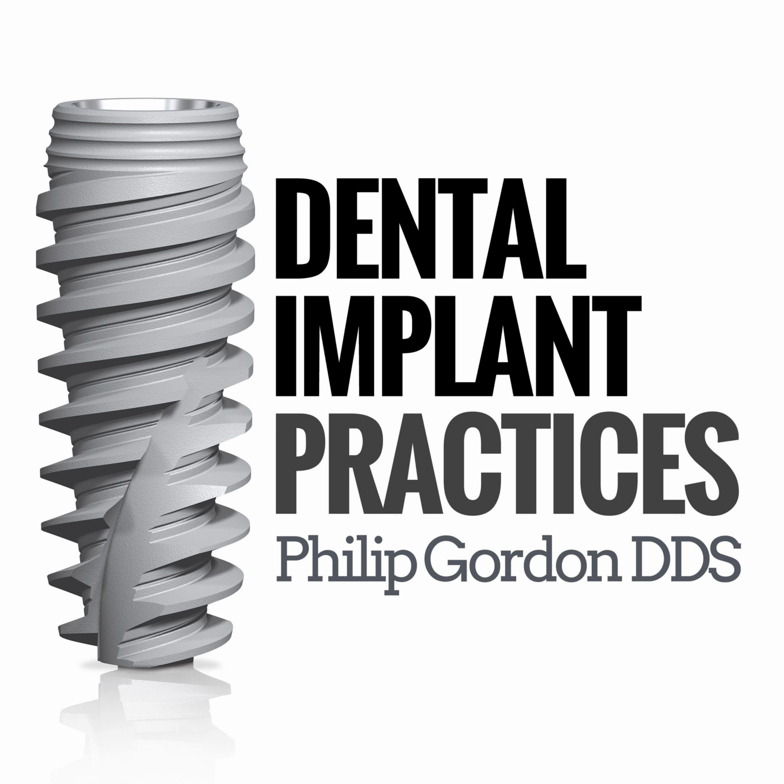Let's say the ridge is a little bit narrow, but when we plan our implants based on the final prosthesis, the deficiency is more to the buccal than it is to the lingual side. So we know when we do the ridge split, we're going to expand the ridge more to the buccal than to the lingual. Then we put the surgical guide in, we place the implants, and the implants go in based on the surgical plan and using the guided surgery guide.